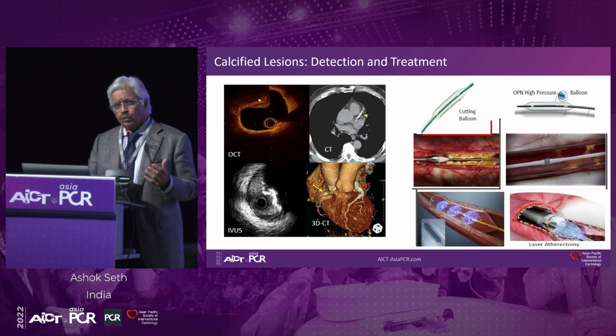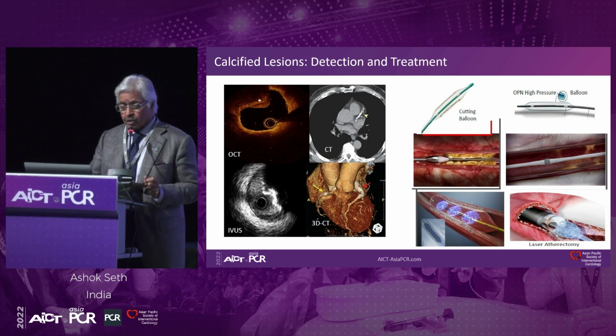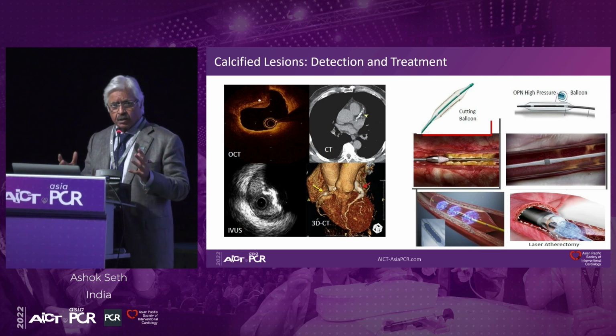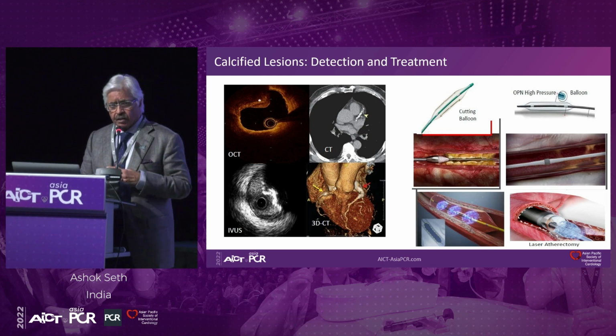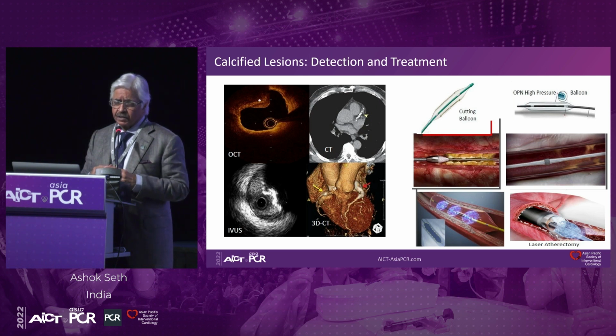Of course, a number of tools have come in over the last 10 years, which now allow us to deal with calcium much more effectively to get better outcomes for our patients. We also have imaging modalities to help us decide which tools to use and how to get the best results. Of course, beyond the scoring and the cutting balloons, which I believe are for mild to moderate calcification, has been atherectomy devices which have been with us for a long period of time. And they really play an important role.